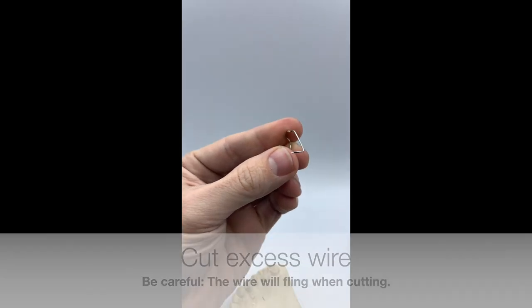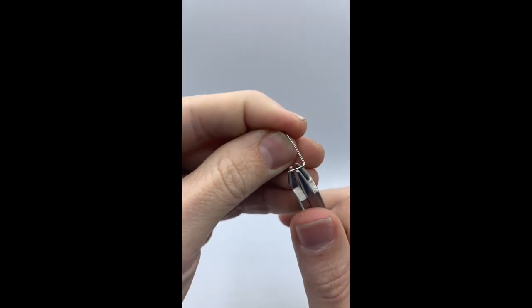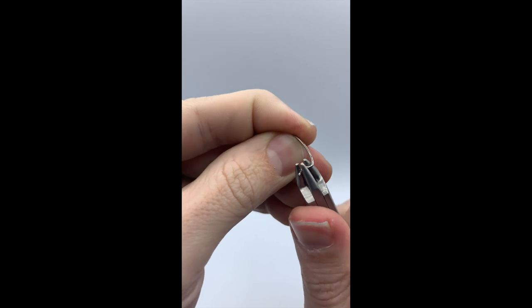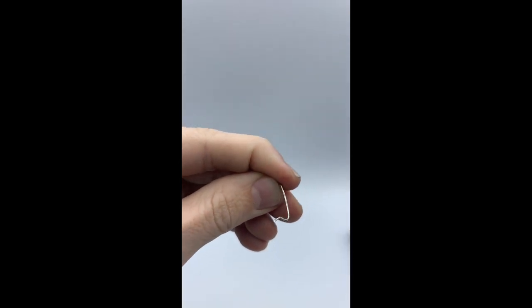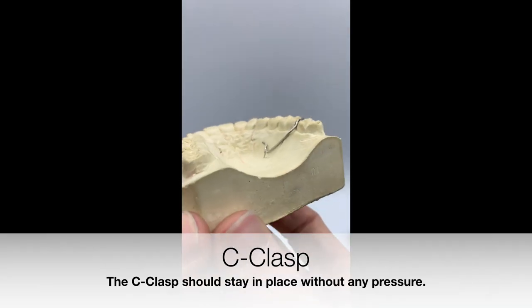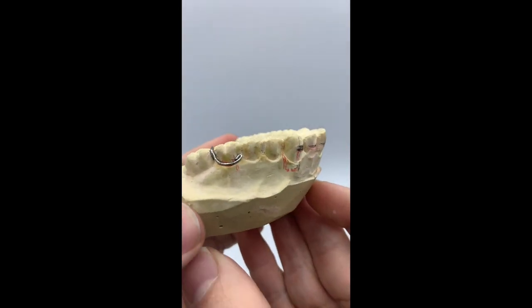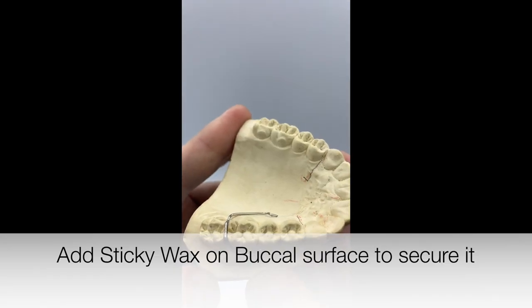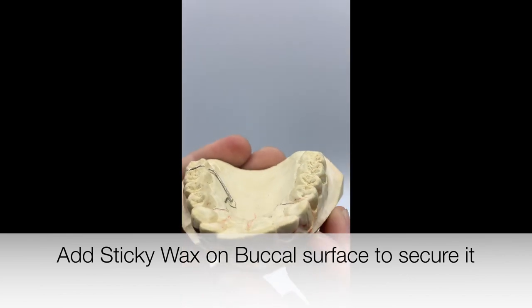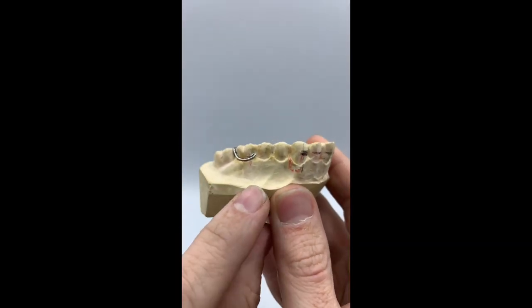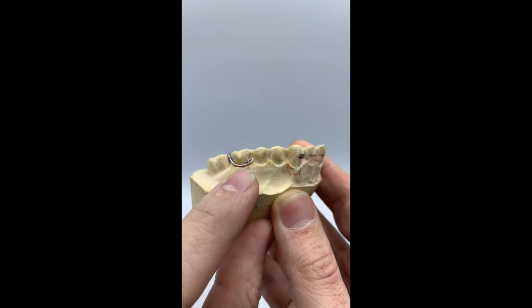Any excess wire on the tail we will then cut off. You can finish your wire either straight or make a little design as seen above. The clasp should sit on the model without any pressure. Repeat the same for the opposite side. You want to add sticky wax to the buccal surface before we start our acrylic work to hold it in place.